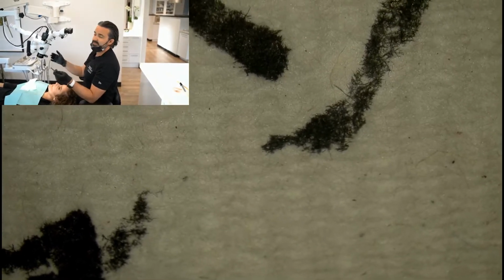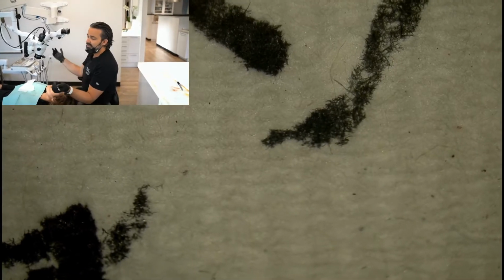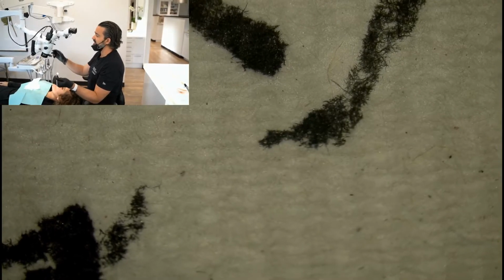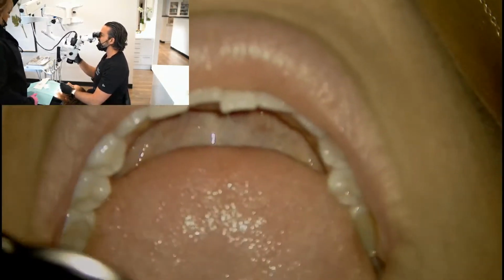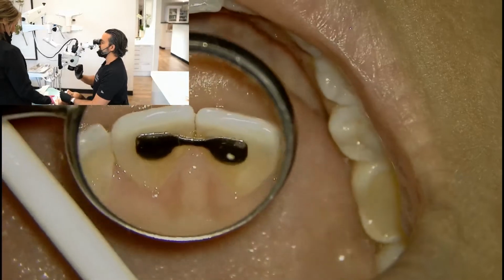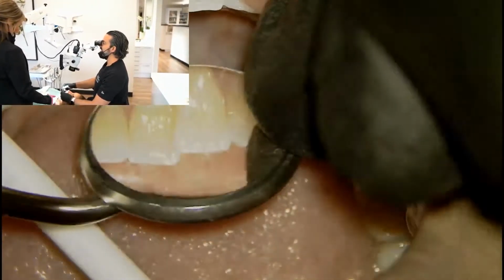The reality is people move, and you might bend over, and the chair might move, the patient moves or swallows. So I find that not a useful trick, because it's really quick just to work at where you want to work, and then just fine focus things down here as I work. And so with my arms, I go back to her mouth. If I want to jump up in magnification, it's so quick just to do this, and then I'm in focus. And so I will move my wrist like this often enough. And it's just real life.